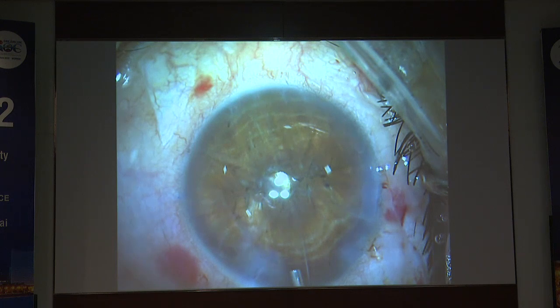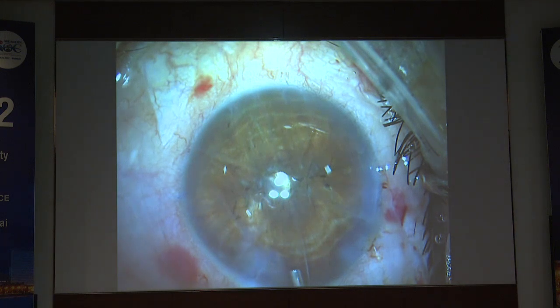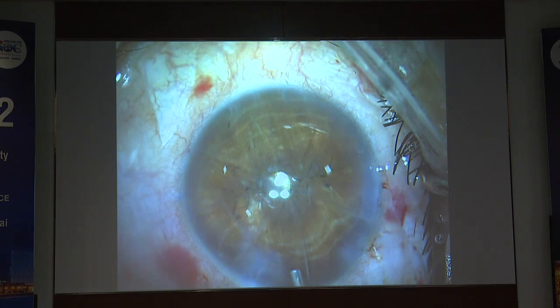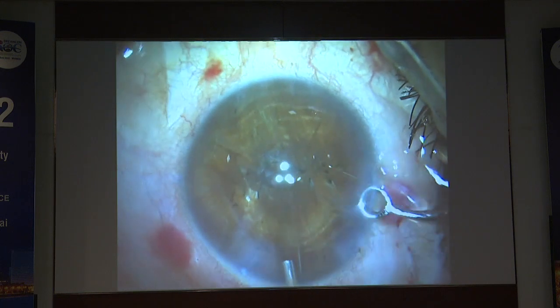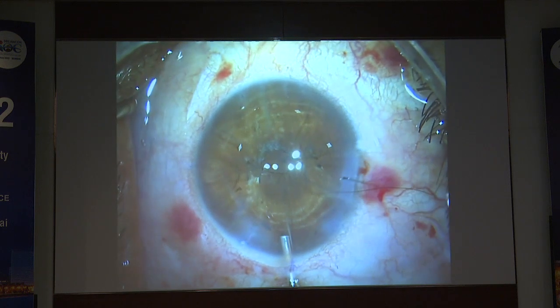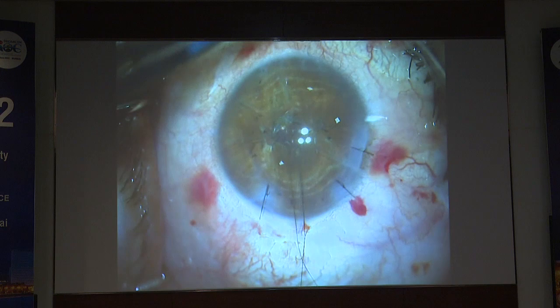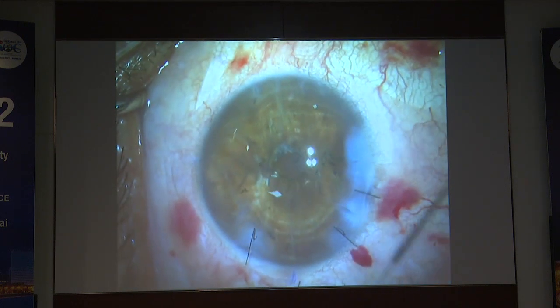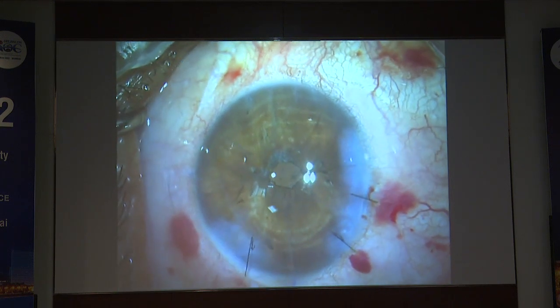Previously I always made the pupil 1.5mm but now I want to fine-tune the pinhole to gain that extra line of vision using the Holliday Pupil device. Once the Purkinje image P1 is centered, I know I'm on track. The RK incisions are sutured up, some having opened. Fibrin glue is used where the Trocar AC maintainer was fixed. These patients do extremely well — if done in the morning, they will be 6/9 or 6/12 by the evening. They also have extended depth of focus, seeing distance and near without glasses.